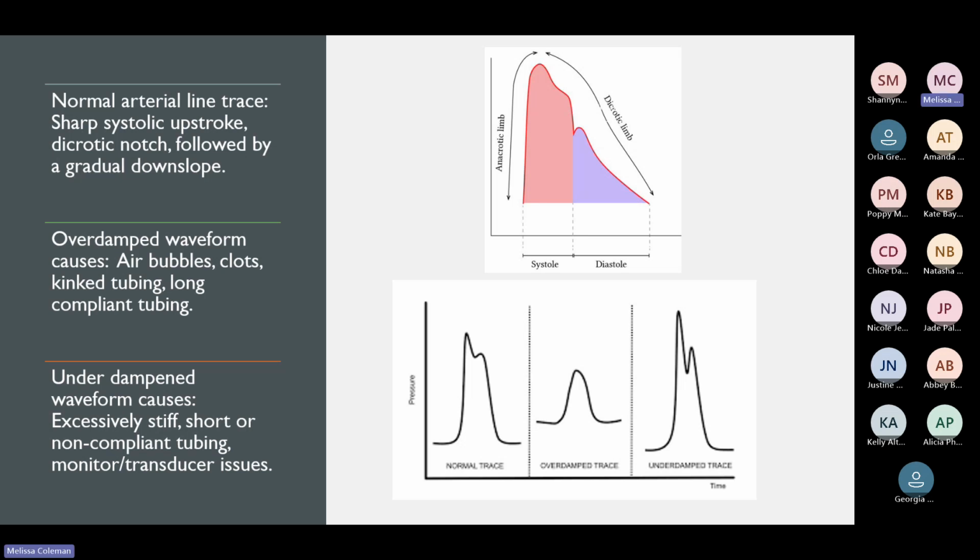So the graph looks like this. This is one of your signals, and there's three parts to that. The ventricular ejection is when you've got the sharp upward rise, and then you've got the dicrotic notch, which is basically the aortic valve closing, and then you go into diastole. The mean arterial pressure is always accurate as long as you have a reasonable trace of that. You've got the part which is systole, so you're going up, and then the diastole is when it comes down and relaxes, and then it repeats.